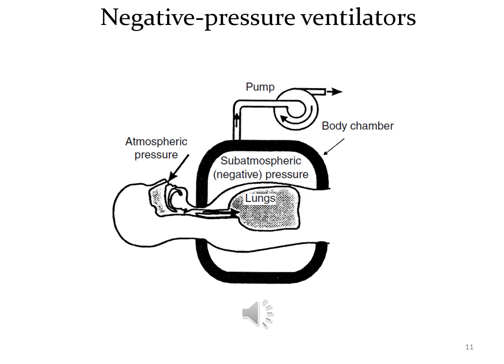The inspiratory and expiratory phases of respiration are controlled by cycling the pressure inside the body chamber between a subatmospheric level for inspiration and the atmospheric level for exhalation. Flow of the breath out of the lungs during exhalation is caused by the recoil of thoracic muscles.